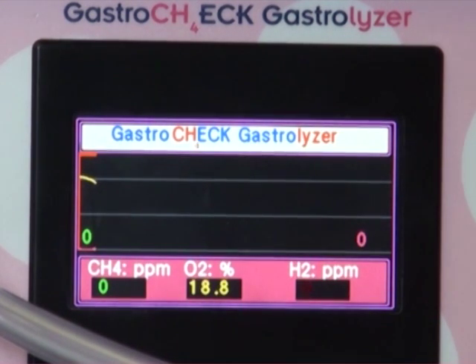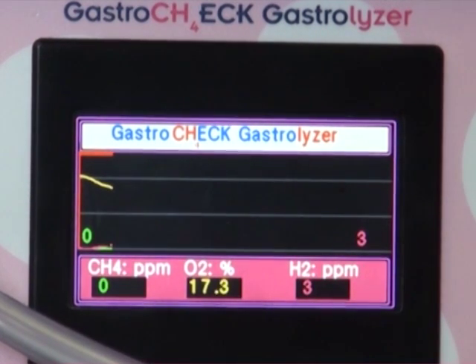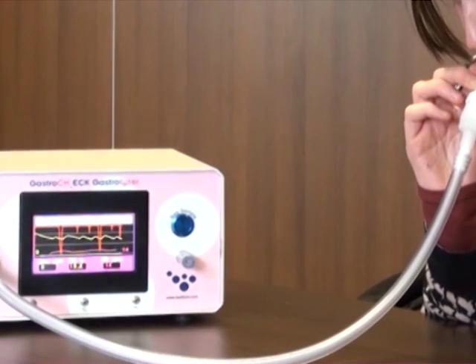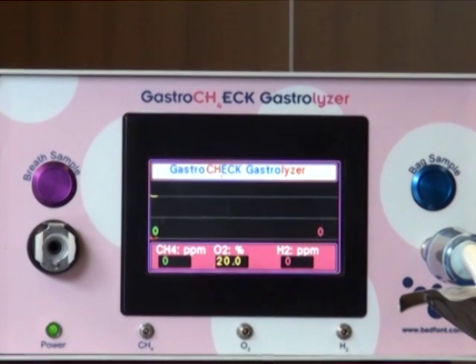Welcome to the How to Use video for the Gastrocheck Gastrolyzer from Bedfont Scientific Ltd. The Gastrocheck Gastrolyzer Portable Breath Methane, Hydrogen and Oxygen Monitor allows health professionals to accurately detect a range of gastrointestinal disorders such as lactose intolerance, bacterial overgrowth, SIBO and many more.